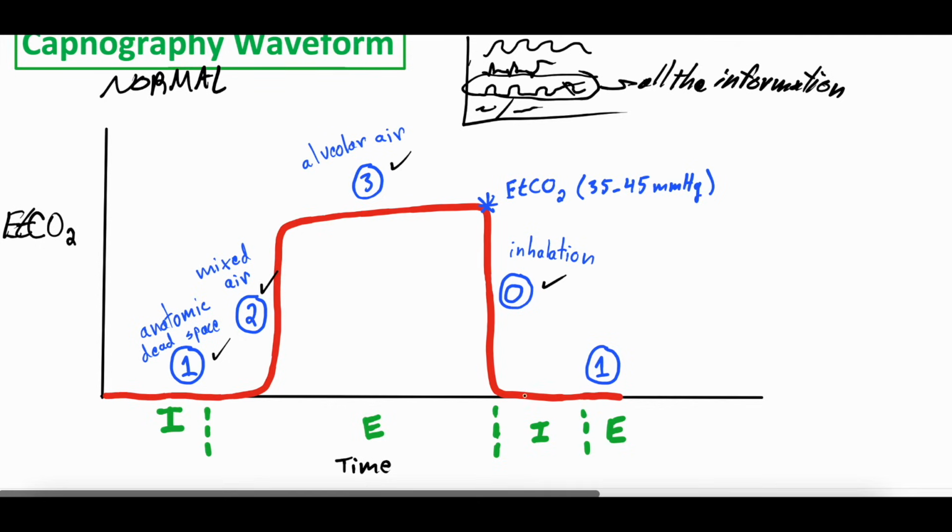And the way to think about this is what is actually happening. I want you just to picture someone who's intubated, has an endotracheal tube, and the end-tidal is detecting the expired carbon dioxide in that endotracheal tube. When the intubated patient is breathing in and breathing out, it's constant, right?